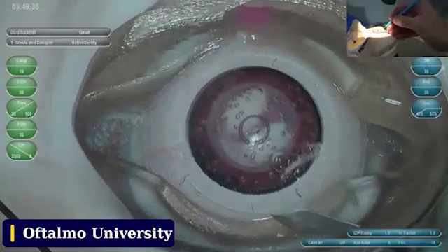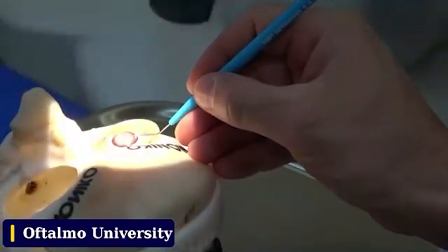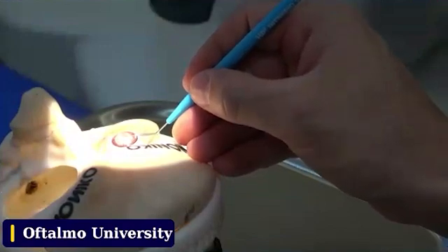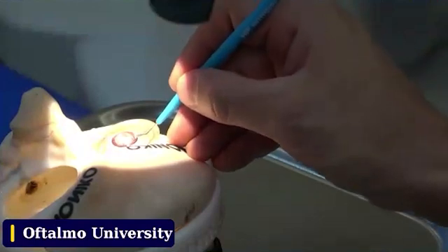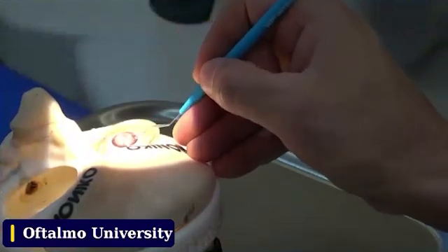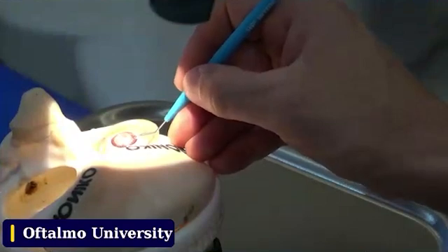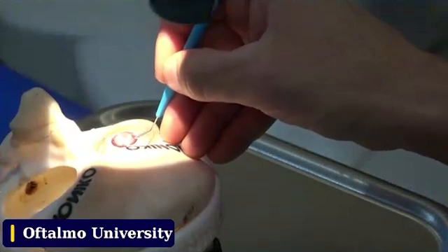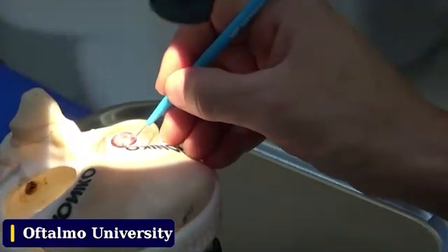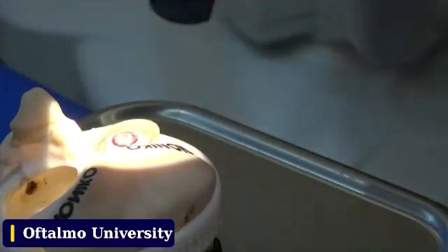Look at my hands — this is the way it looks in a correcting session: in and out. Let's do it again so you can see perfectly. Only in your hands: first plane, second plane — I enter and I go in and out. That's exactly what I want you to have in mind.